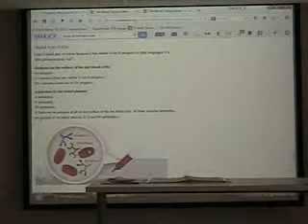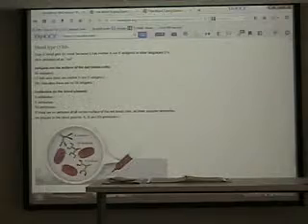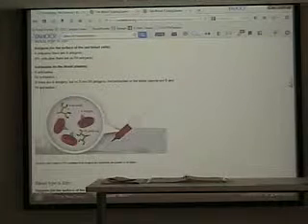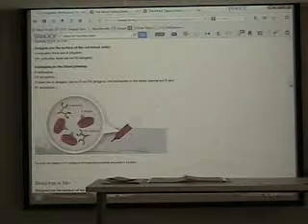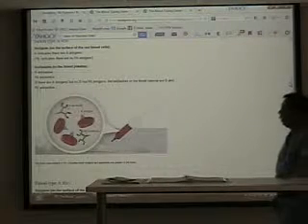Okay? All right, and that's the ABO blood typing system. Now let's look at these same pictures and let's look at RH. RH factors or RH typing is extremely important, especially with obstetrics, because of hemolytic disease of the newborn.